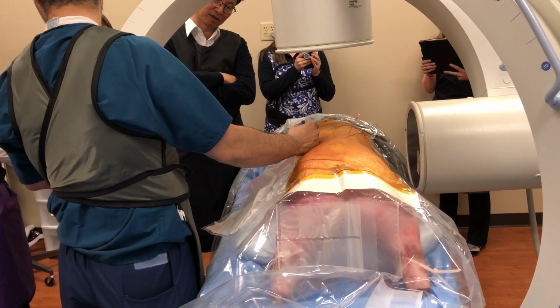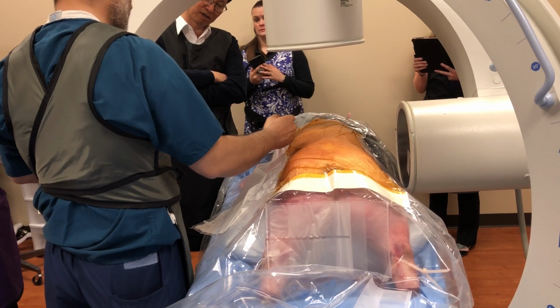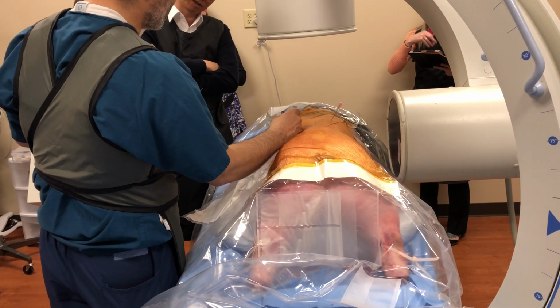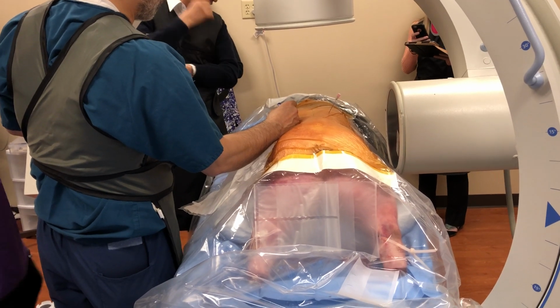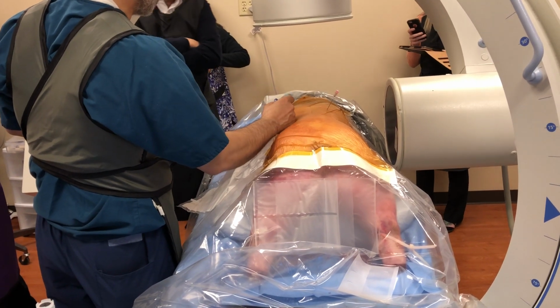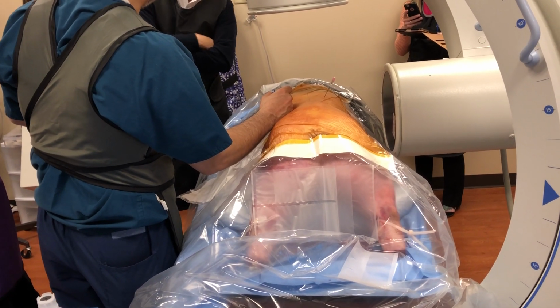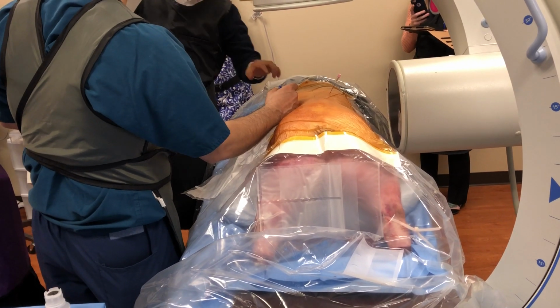How about L5S1 too? We get to that. Yeah, more lateral. Absolutely. And for scoliosis, I want to be more closer to here to pass to the other side. And on top of that, there's a new approach that we have described. We wrote a paper about it called MIS-DLIF, direct lateral.